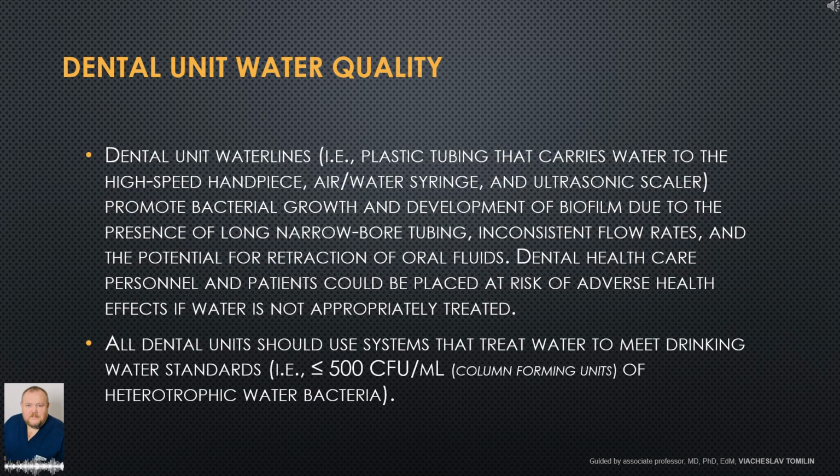Dental unit water quality. Dental unit water lines, that is, plastic tubing that carries water to the high-speed handpiece, air-water syringe, and ultrasonic scaler, promote bacterial growth and development of biofilm due to the presence of long narrow-bore tubing, inconsistent flow rates, and the potential for retraction of oral fluids. Dental healthcare personnel and patients could be placed at risk of adverse health effects if water is not appropriately treated.